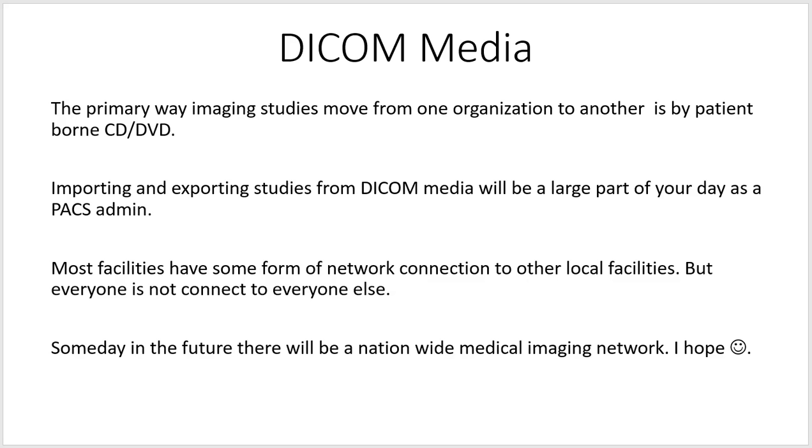If you go on vacation in the Bahamas, you would share your vacation photos on Facebook or Snapchat. You could share them all kinds of ways through all kinds of different applications. But if you have a chest x-ray and you want to get it from Philadelphia to Pittsburgh, you're going to have to burn that on a CD and carry it with you. Importing and exporting studies from DICOM media will be a large part of your day as a PACS admin.